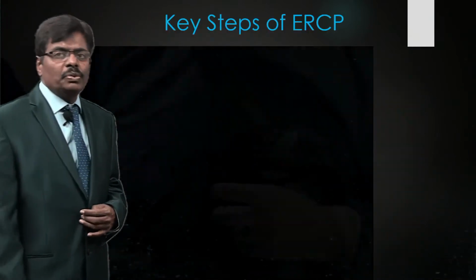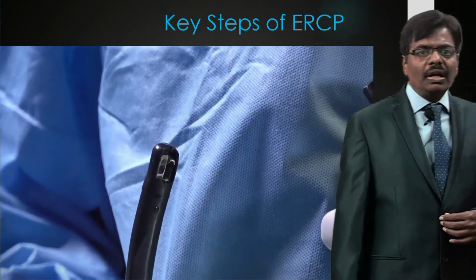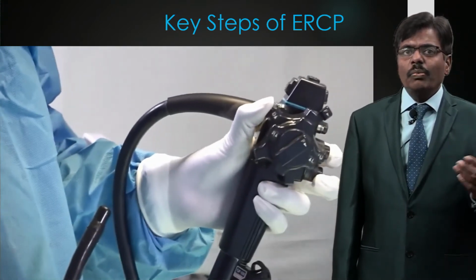That's what we are, I am sure. Let us watch one case, then we'll go. Here is what I am saying about the elevator. As you can see, I am testing the elevator going up and down, because if it is not working, there is no point in proceeding.